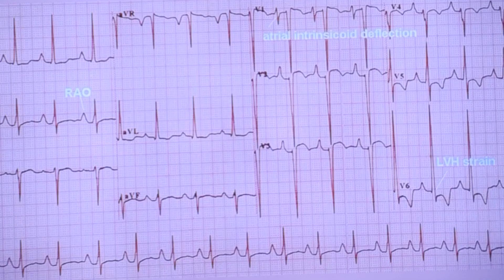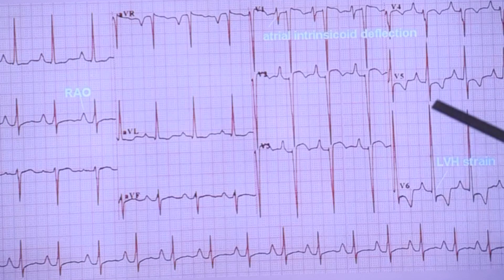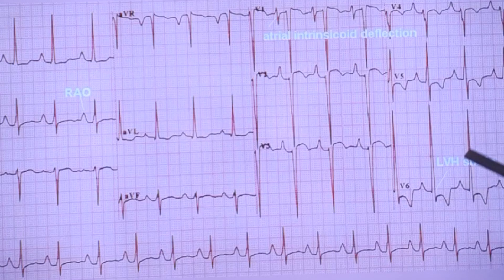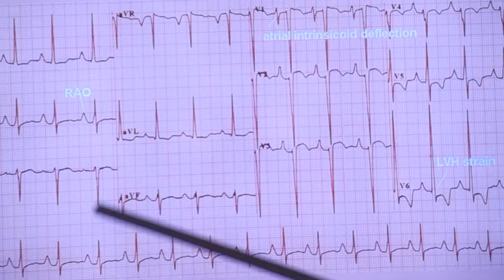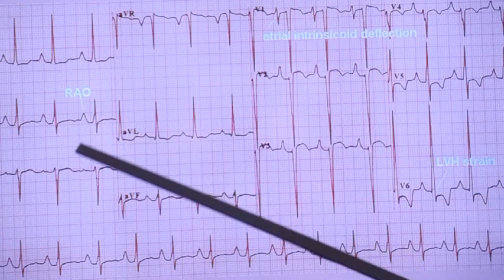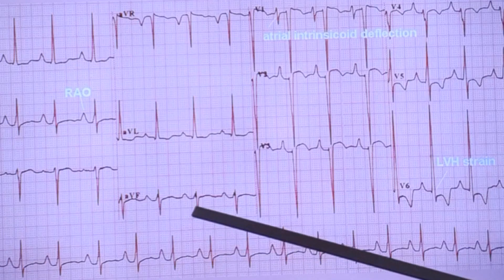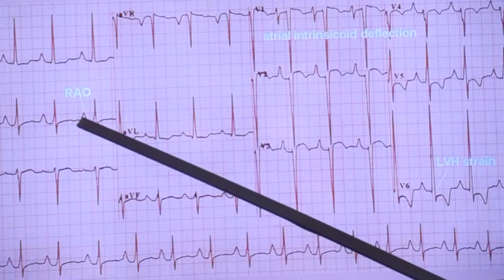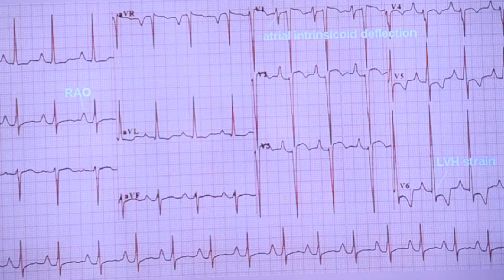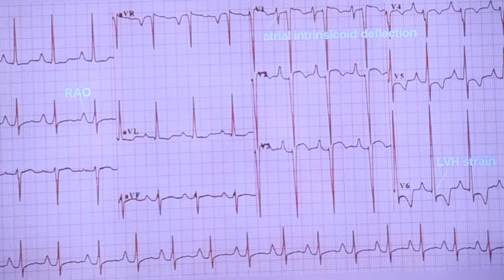But if in a cyanotic heart disease you are seeing left ventricular forces — here you can see a very tall R wave with ST depression and T inversion, left ventricular hypertrophy with strain pattern — if that is seen in a cyanotic infant, you should think of tricuspid atresia. The other findings here are right atrial overload, almost leftward axis, and negative complexes in leads 3 and AVF — leftward axis with tall peaked P waves suggesting right atrial overload. The right atrium is overloaded because the tricuspid valve is atretic.